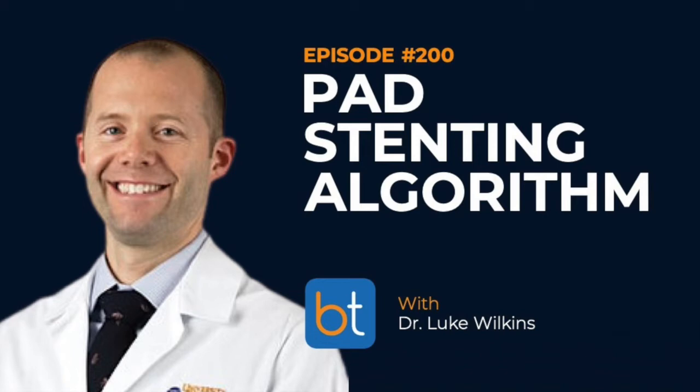Got it. So the next step in the flowchart says, if there's no dissection or residual narrowing, you proceed with the DCB. Just a quick note for any trainees that may be listening with regards to DCB. People who use DCBs frequently will think this is common knowledge, but I think for the trainees, it might not be. The way to think about DCB is that it's just delivering drug. It is just a vehicle to get drug on the wall. You're not treating the lesion with angioplasty. You are laying down drug on a vessel that has already been treated, and you have lumen gain with whatever treatment you have provided. And the DCB is just used to prevent any degree of restenosis. That's why I have it after follow-up angio with residual narrowing greater than 30% or flow-limiting dissection. So if your vessel looks pretty and you're happy with it, then you can lay down some drug.